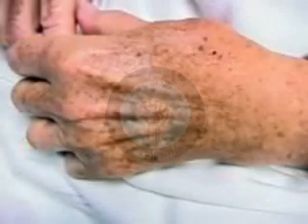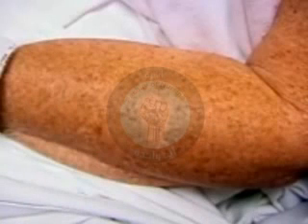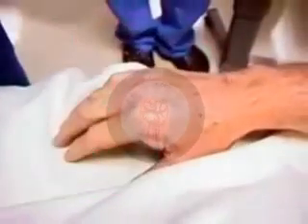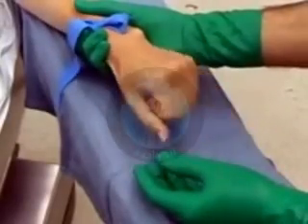When a vein is difficult to see or to identify on palpation, several methods can be used to increase its dilatation. These include lowering the arm below heart level, gently tapping on the vein, instructing the patient to open and close his or her fist repeatedly, and applying a warm compress to the selected site for 3 to 5 minutes to increase vasodilatation.